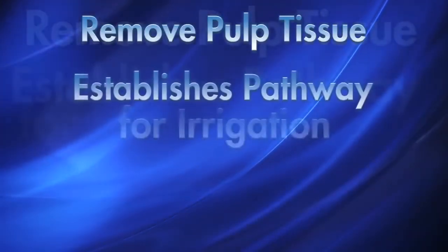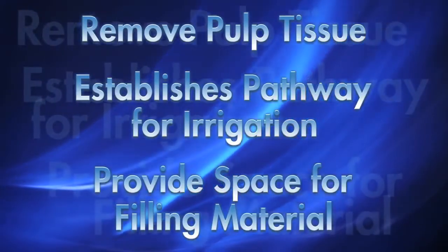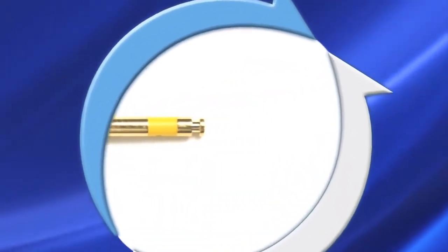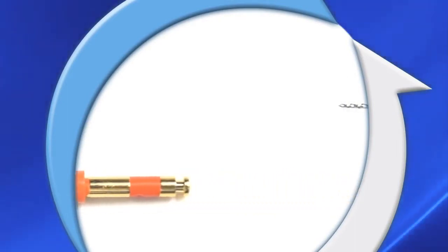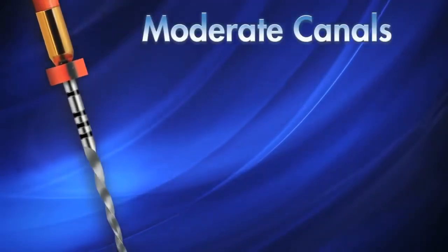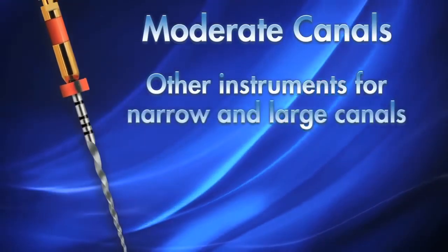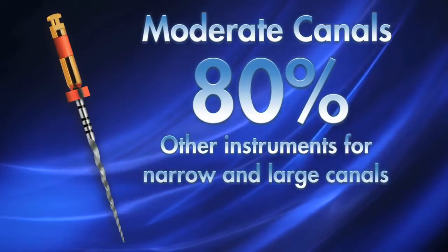Effective shaping of the root canal system is essential for achieving the objectives of endodontic treatment. The Wave 1 system is an extraordinary canal preparation technique. It relies on only one engine-driven instrument, used in a proprietary reciprocating motion and employs cutting-edge M-wire NiTi technology. The primary Wave 1 file is recommended for moderate canals — neither overly wide nor too narrow — representing approximately 80% of clinical situations.